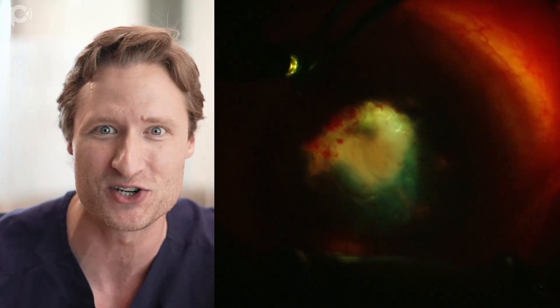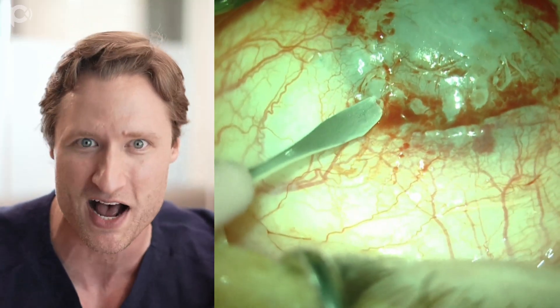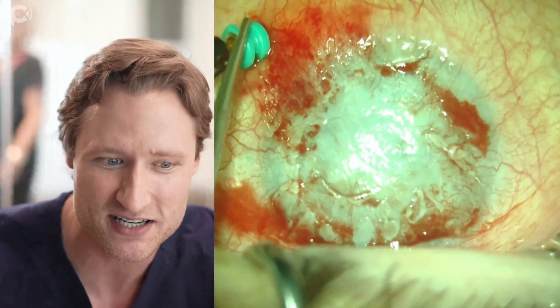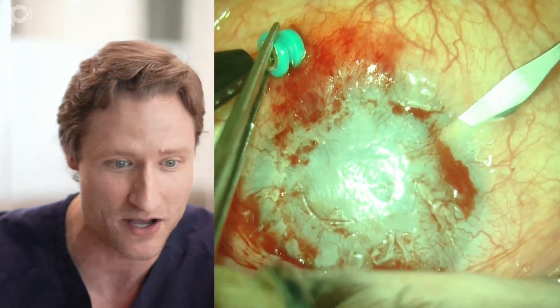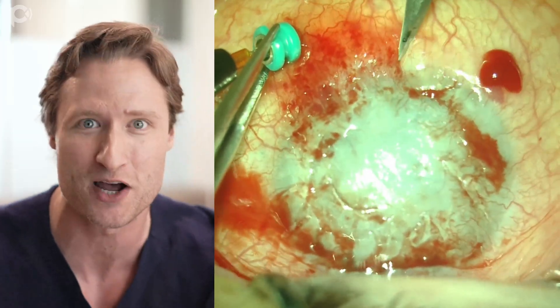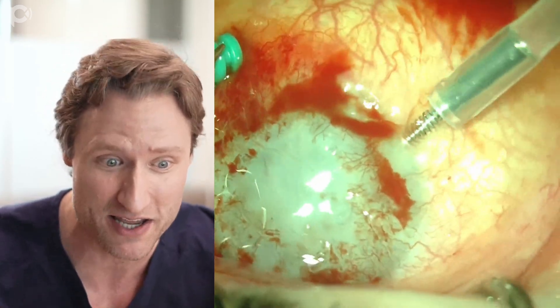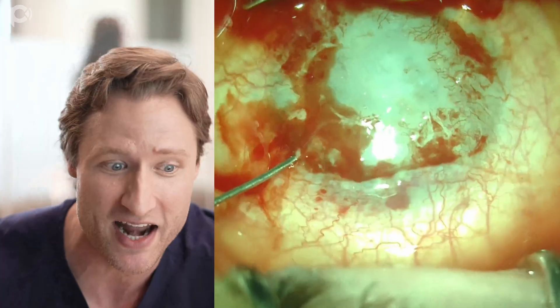When I saw this, I got so excited because I thought maybe this operation is possible. So I proceed to start making some paracenteses to gain access inside the eye. This is a small eye with a small-diameter prior PK, so I'm making these incisions big, way out beyond the limbus, and I want big wounds so I don't have any trouble coming in and out of them.